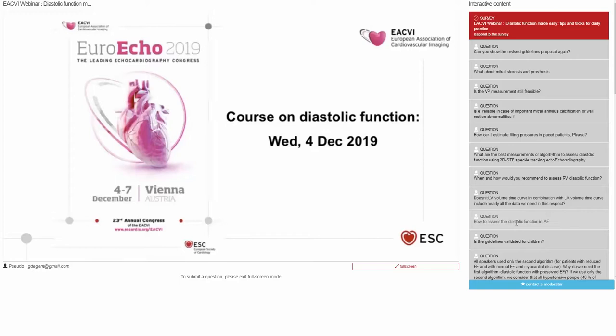Yeah, Emma, why don't you go, please? No, I guess in Europe there is more use of the supine bike, which has the advantage that you can follow throughout the test. But indeed, I agree with the point of Jay that you can do that. Yeah. And it's important that you look at the E and A waves when they unfuse. I showed the example.